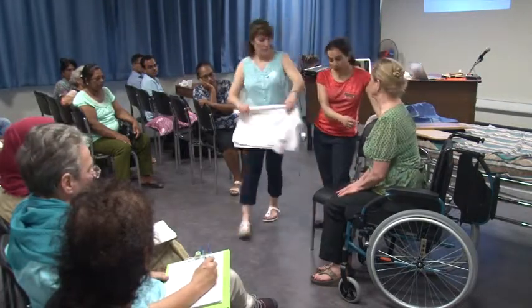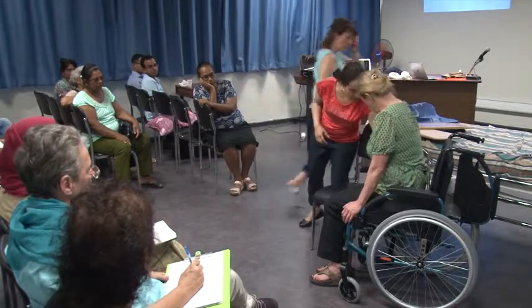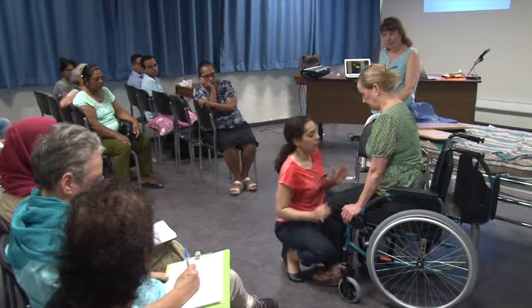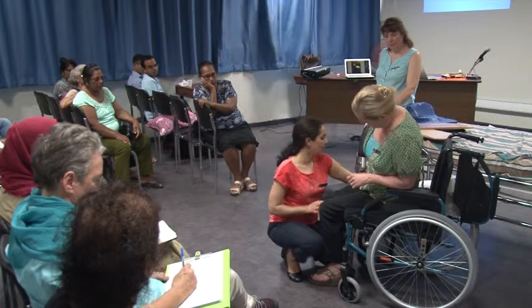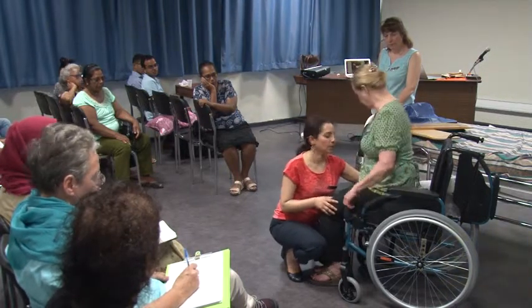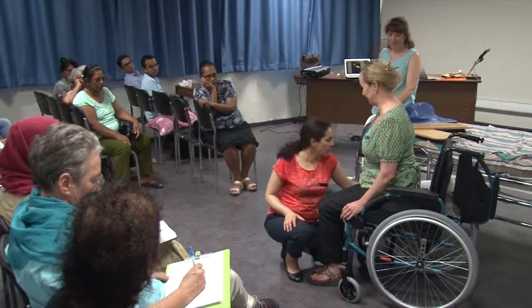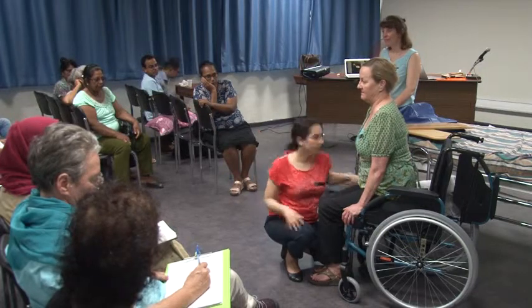So maybe Fiona needs to come further forward to miss that wheel, because now if she transfers from here, she's going to hit the wheel, right? So I would be again asking Fiona to lean onto her left, get this side only a tiny bit forward, so we are now well clear of the wheel. Here we go. We've covered the wheel just in case, because things can still go wrong. Slide board is a slightly dependent transfer. We covered the brakes as well, because brakes are sticking out and you can hit the button.